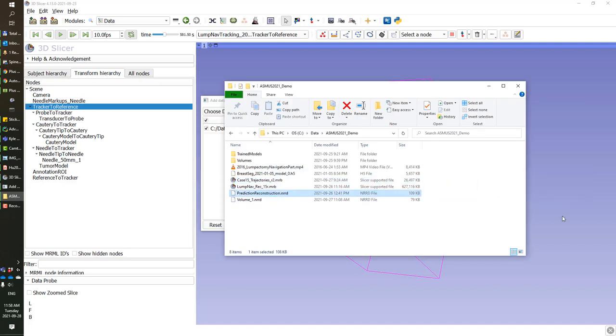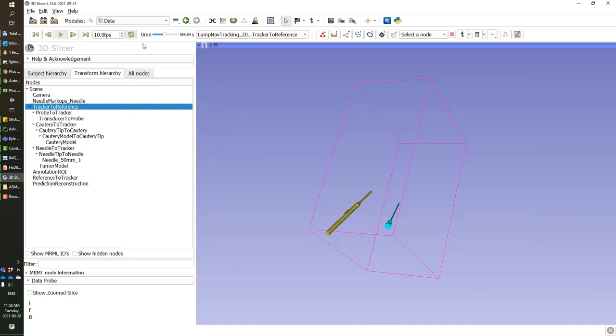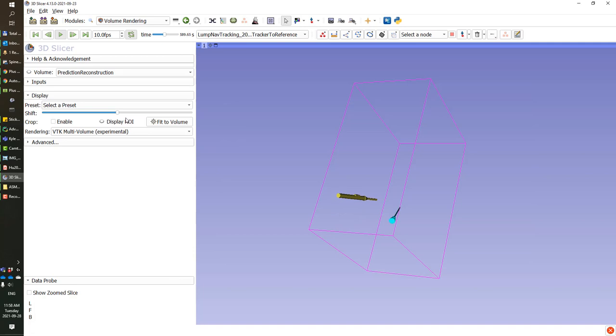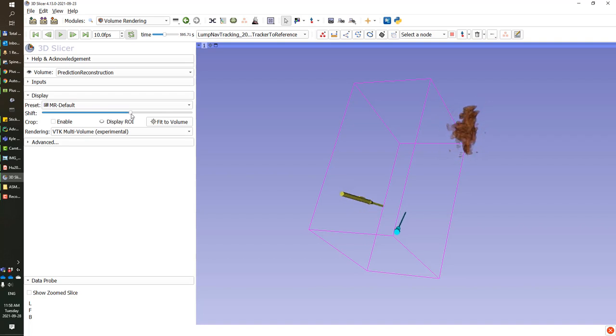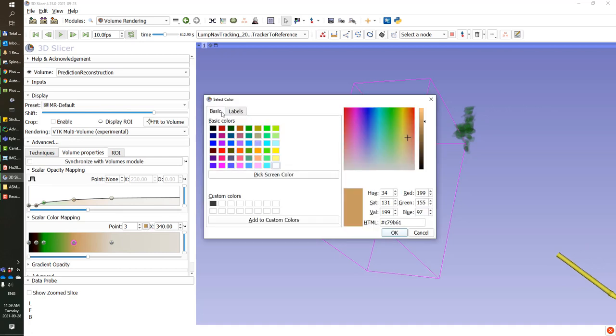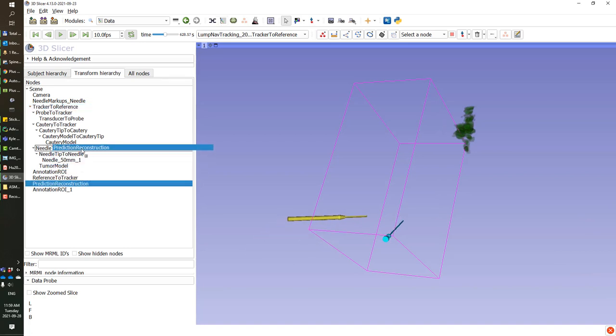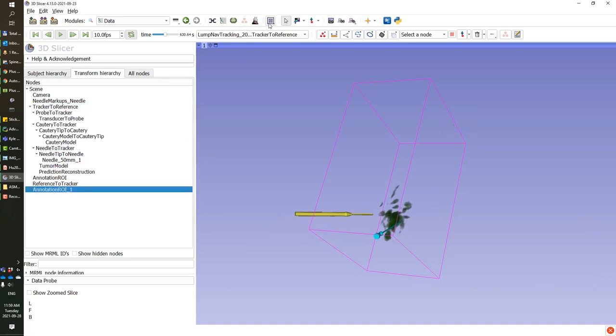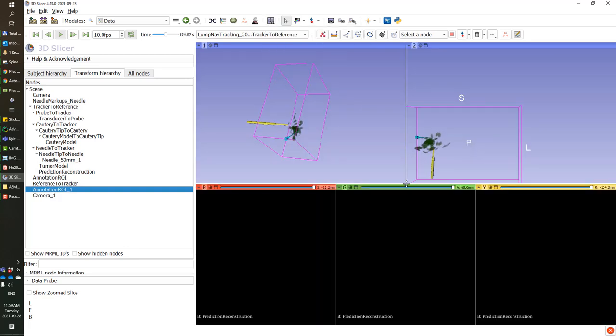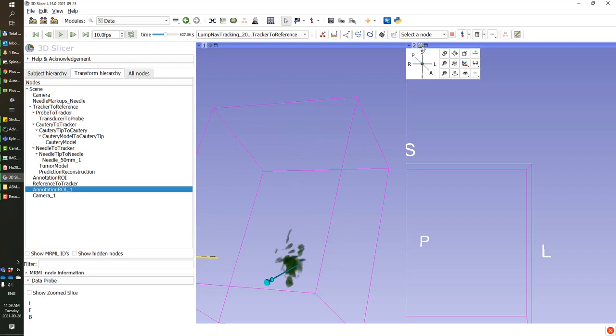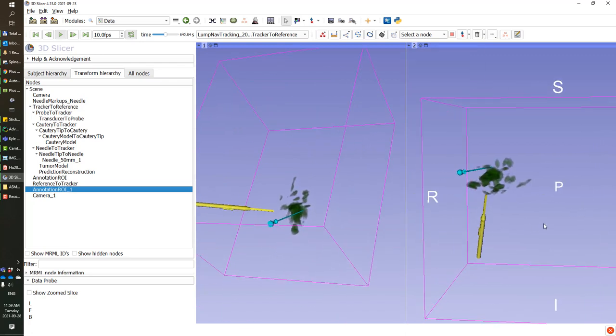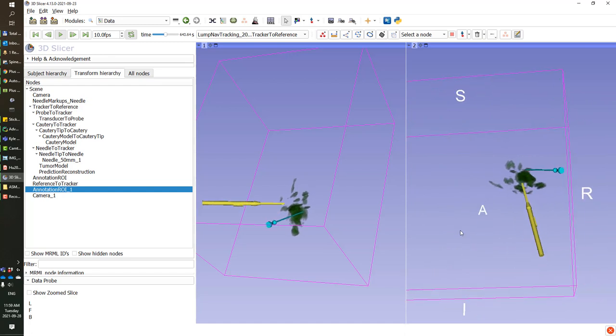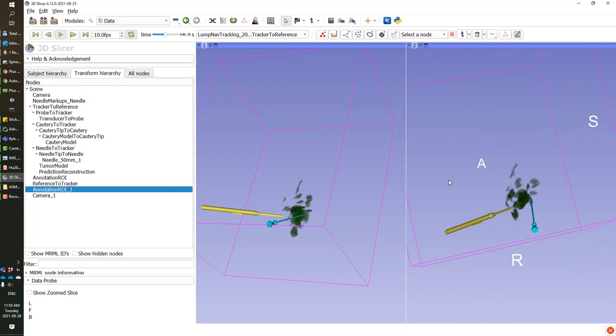So now that we load the prediction reconstruction that we have saved previously, we just need to enable volume rendering in this scene as well to show it. Increase the threshold a little bit, and you can apply all the volume rendering options, for example, to change the color of the volume to something that stands out more. And finally, we put this reconstructed volume on the needle coordinate system so it is displayed in the correct position, and it can be used during operation to navigate the cautery device around the visible tumor prediction.